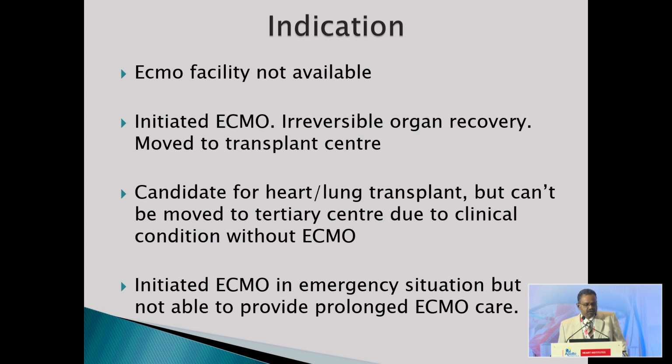And there are candidates for heart and lung transplant who can't be shifted out of the ICU or transferred to the transplant center without the ECMO. Some of the patients we receive, like for lung transplantation, will be on a ventilator with FiO2 of somewhere around 80%. Those people can't be transferred safely.